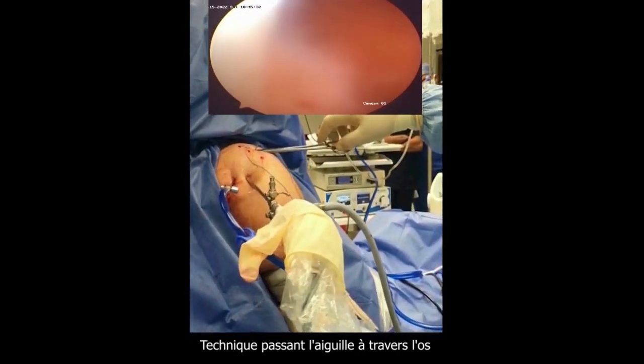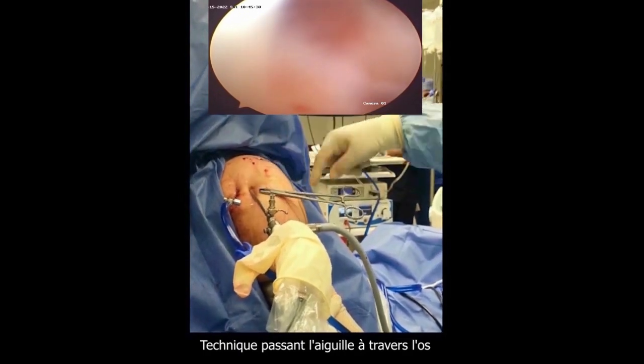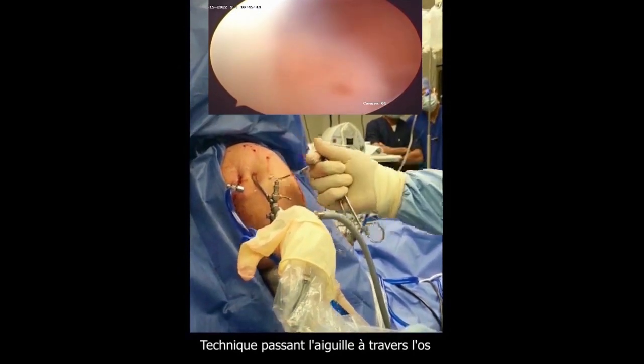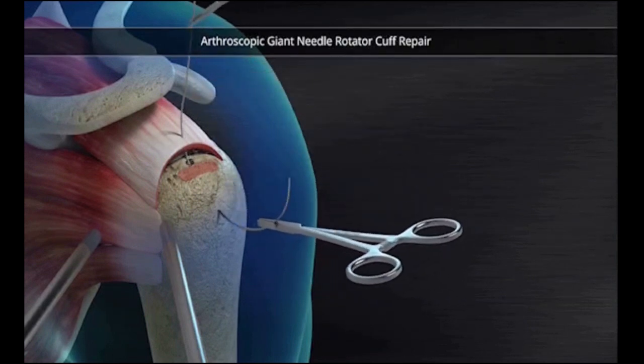Here we see the tip of the needle. It will be held with the needle holder and pulled out same as it was pushed in. Here we see a demonstration how the needle is pushed through the tendon, through the skin, and out through the bone in a stepwise manner.